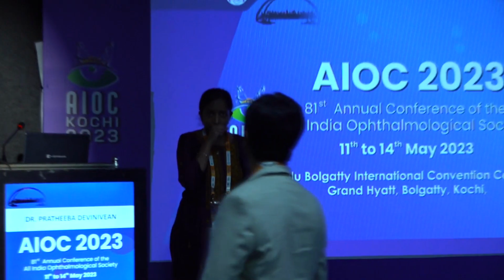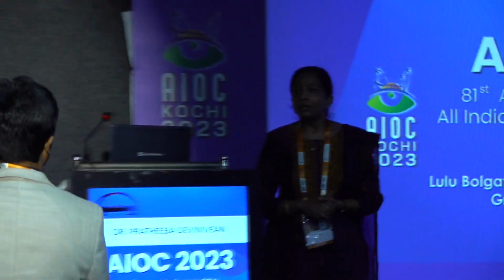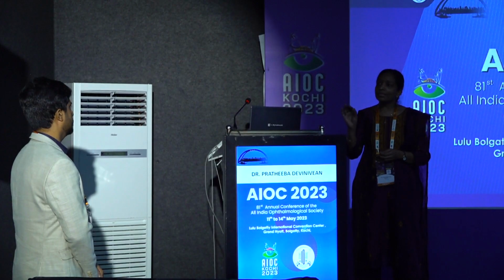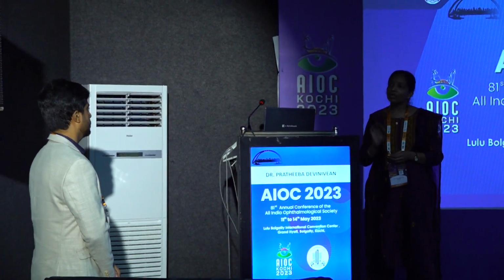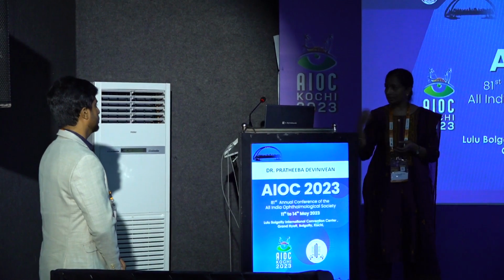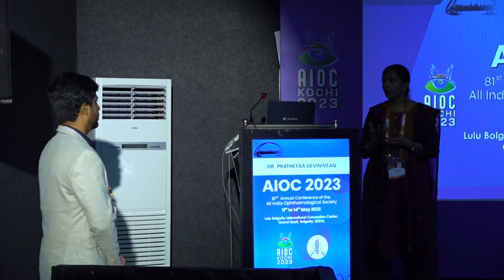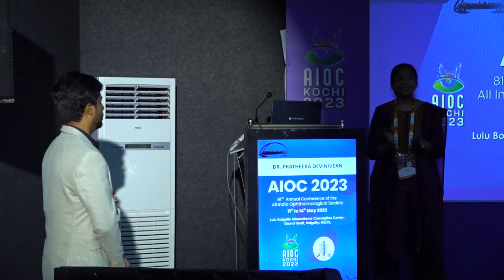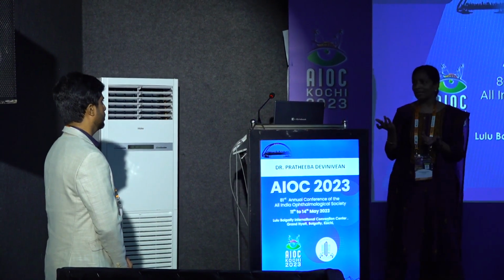What data do you have to send to the company when you do a workup? They only ask for the DICOM data. We have to specifically tell the radiologist to give the DICOM data of the CT images. Then there is a technical person who makes the STL models. If we hand that over, they will give the model. It's just like a skull model, nothing different.